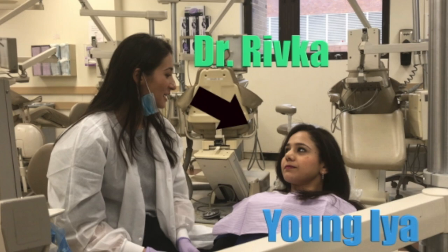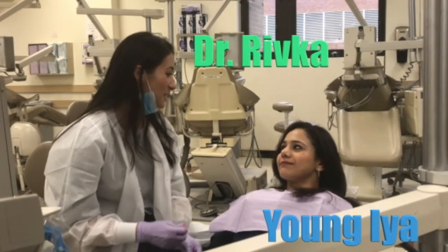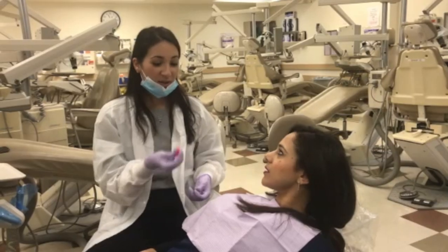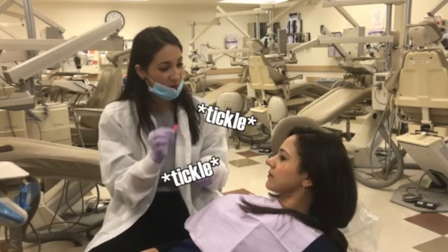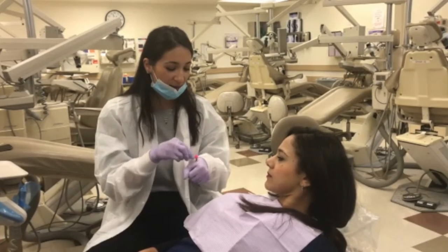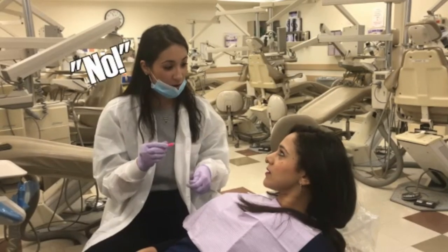Hi! I'm Dr. Rivka and we're going to be cleaning your teeth, making sure that they're extra shiny and squeaky clean. So this is my toothbrush — we're going to be brushing your teeth. It's like a spinning toothbrush and it's going to tickle with a little vibration, so it's going to feel like a little tickle. Do you want to feel? Is it going to hurt me? No, it's just going to tickle.